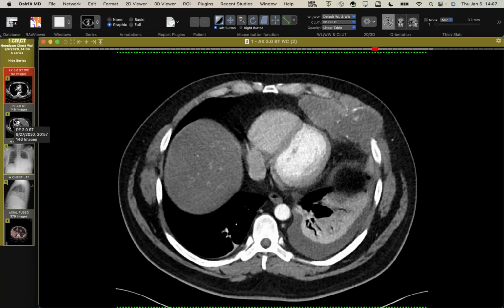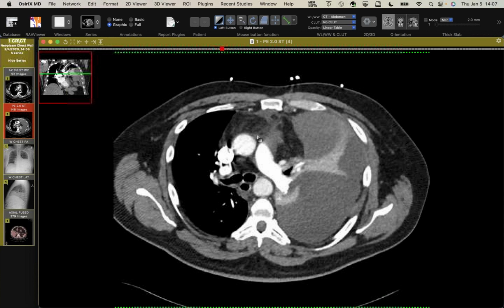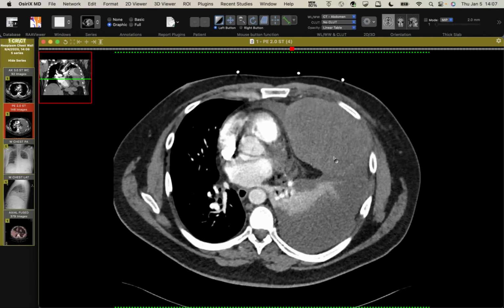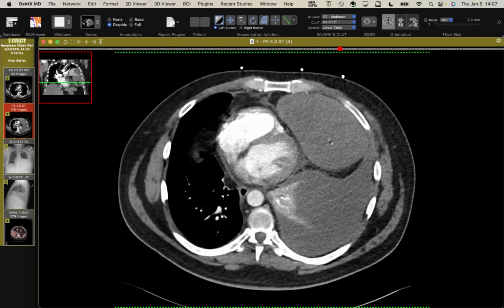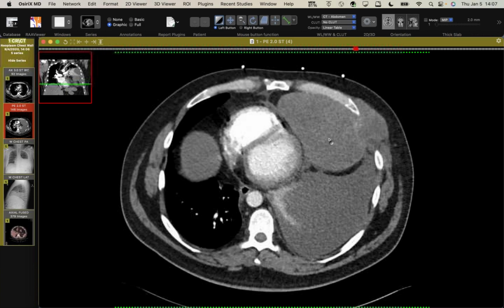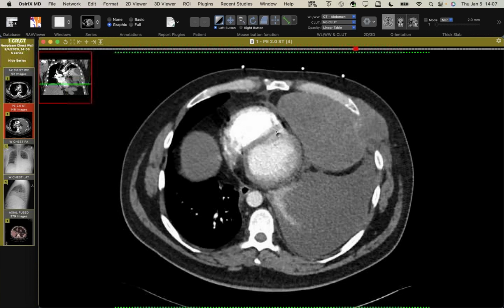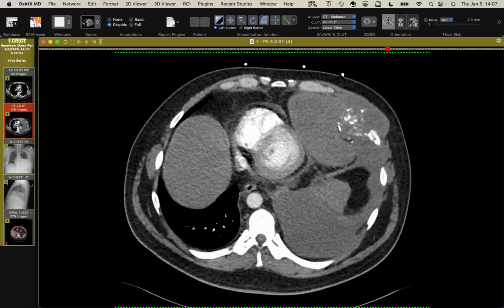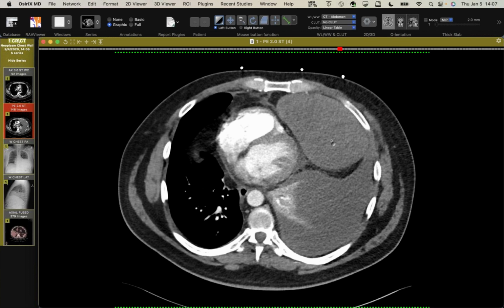Now, if we fast forward just about 3 weeks, this is when he came to ART and was transferred to us or referred to us. This effusion had gotten much larger, but this is a mass here. I think this was interpreted as an effusion elsewhere, but this is actually a soft tissue mass, that mass that was there before. So it's grown rather quickly over the course. It's pushing on his heart. He was having a lot of pain. And so this was biopsied, and this is a dedifferentiated chondrosarcoma. You can see this portion here looks like your typical chondrosarcoma. They got some cores from this area too, and this showed the dedifferentiated component. So this was the part that was aggressively growing.